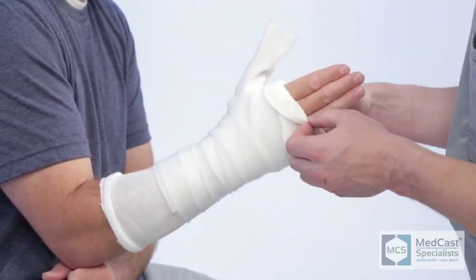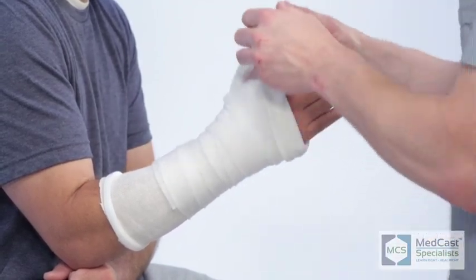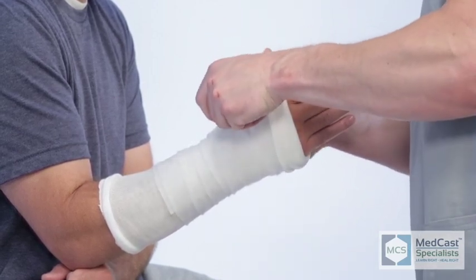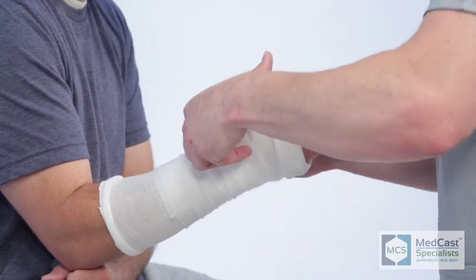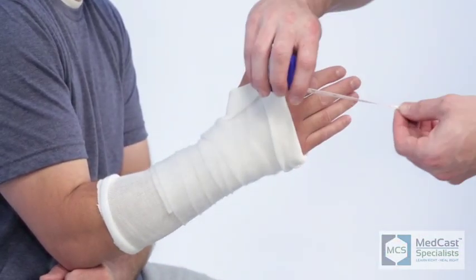For both ulnar gutter and radial gutter, we start the cast the same way as a short arm cast — with the arm stockinette and the thumb stockinette. Where the injury is typically in the digits or the metacarpals, the cast does not need to be as long, so you can go shorter on the forearm unless your physician has another request.